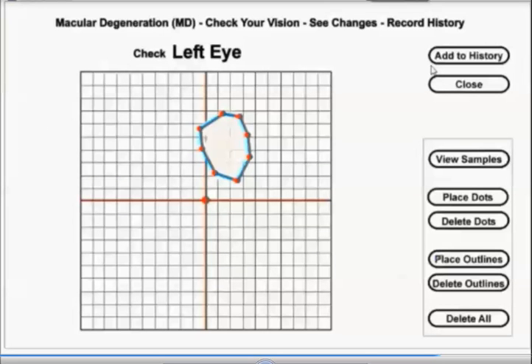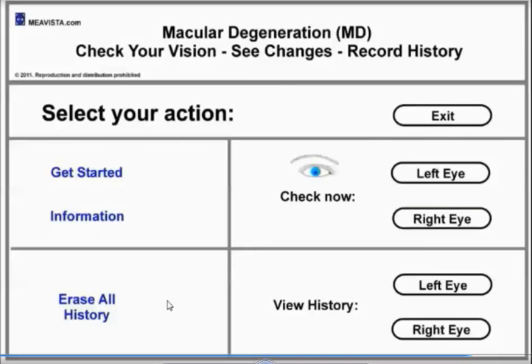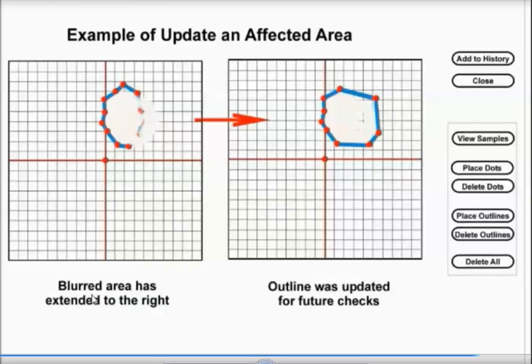The next time when you check your eyes, the last saved view is displayed and you can easily see if the affected area has changed in size or location. If there are changes to the affected area, the outline with red dots and blue lines can easily be updated according to these changes in your vision. In this example, the blurred area did extend to the right and the outline was updated accordingly for future checks.